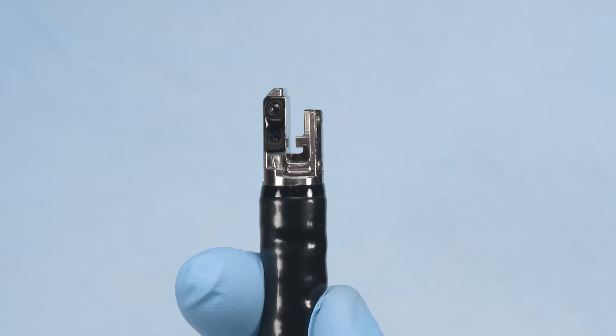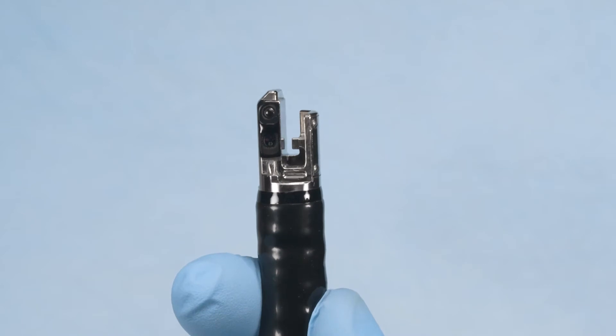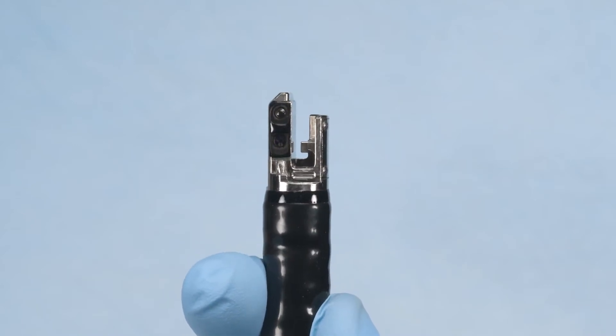Check all components of the distal end for any abnormalities such as attachment of foreign material, scratches, or chipping, and ensure that there is no gap on the periphery of the lens.